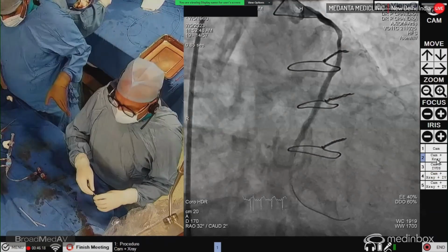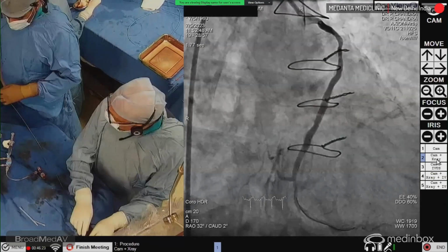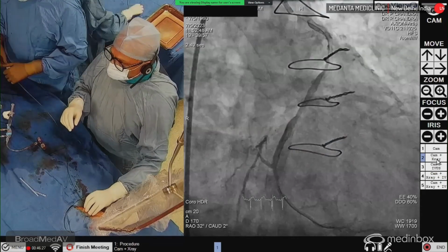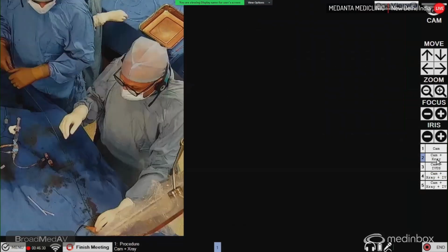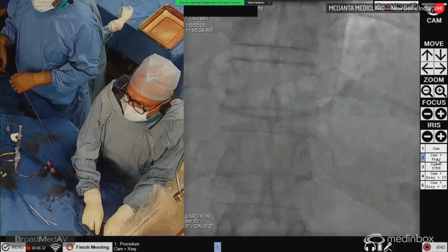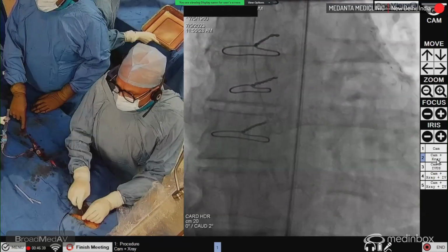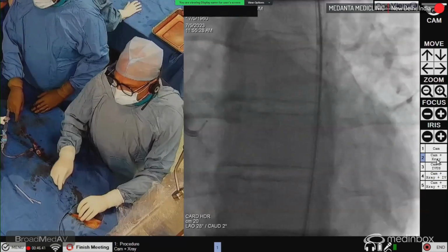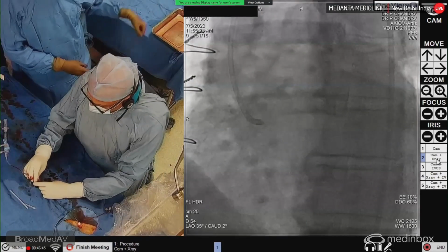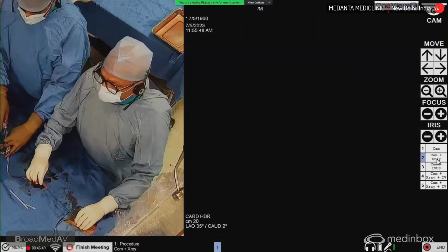So show the RCA lesion from the angiogram, just for recapitulation purposes. Okay, so we are now heading towards the native RCA, which is proximally everything is okay. Although calcified, we might find some difficulties in going through. So we are aware of that. We can check now.